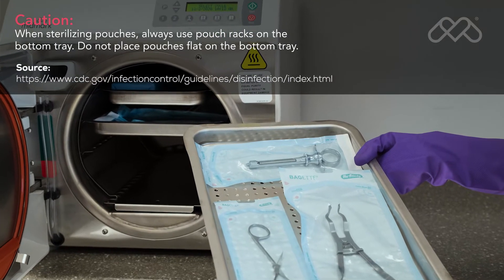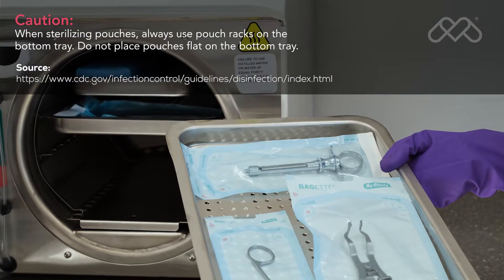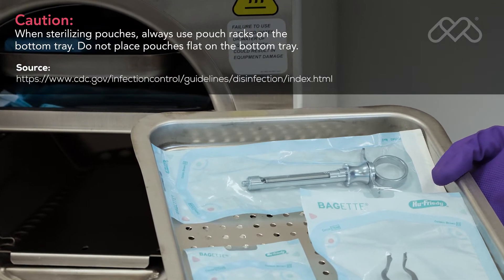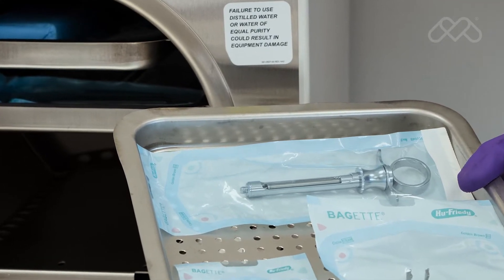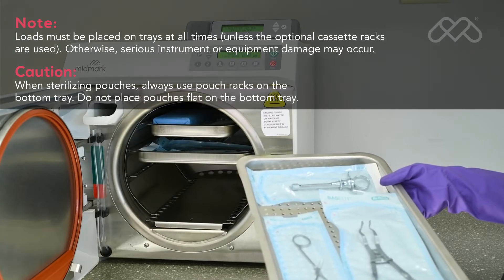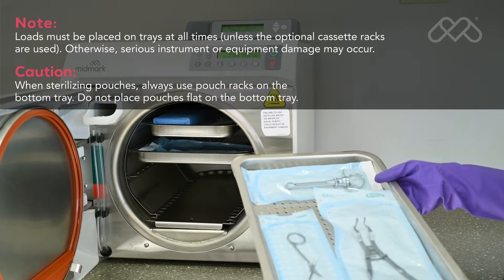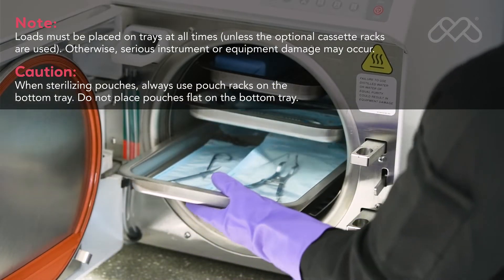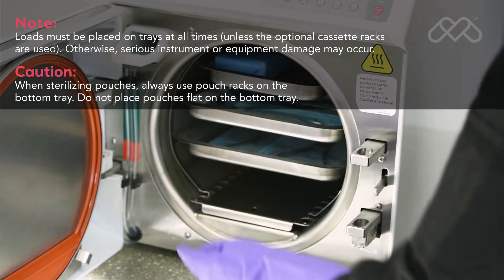According to the CDC, items to be sterilized should be arranged to permit free circulation of the sterilizing agent, and the manufacturer's instructions for loading the sterilizer should be followed. When using an M9 or M11 steam sterilizer, loads must be placed on trays at all times, unless the optional cassette racks are used, to avoid serious instrument or equipment damage.